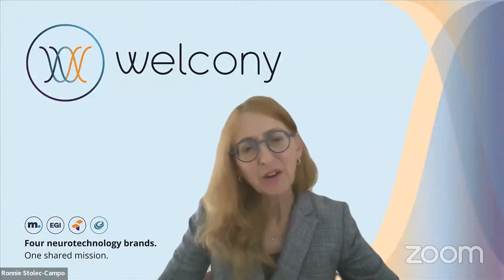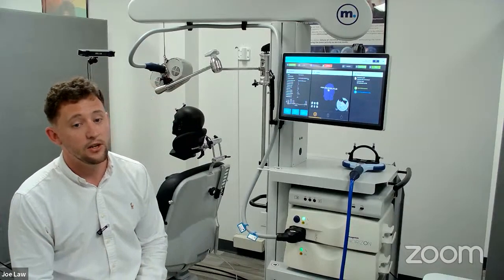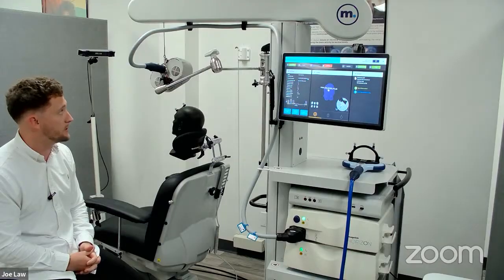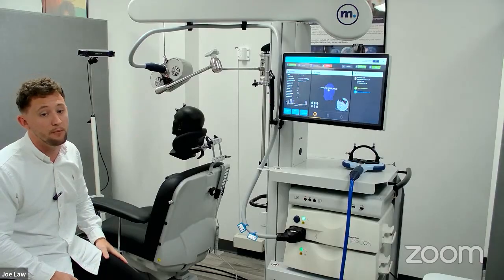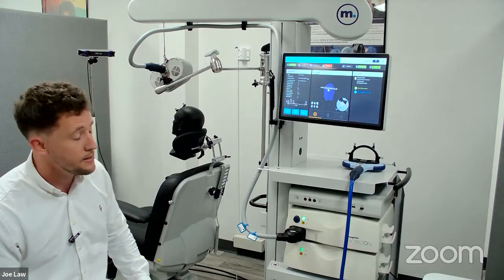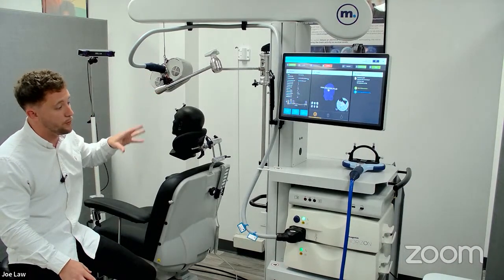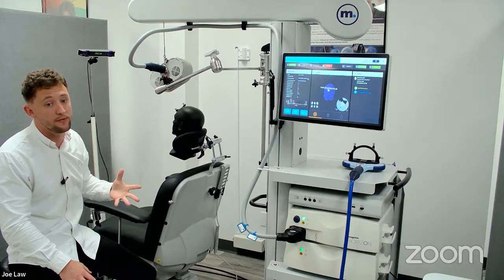Joe, do the air film coils or the air-cooled coils require annual maintenance like some of the liquid cooled? No, so there's no maintenance needed on this coil. We have something called EPV, which is essentially a shot counter. The coils standardly have a 5-year lifetime, or one of the highest shot counters on the market, which is 40 million shots. After 5 years or 40 million hits, the system will tell you it needs maintenance or service.